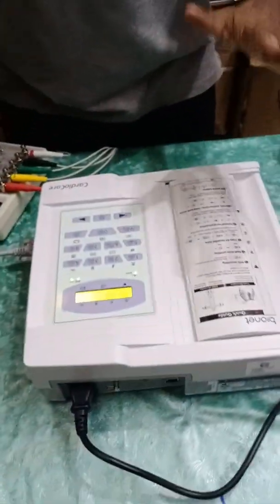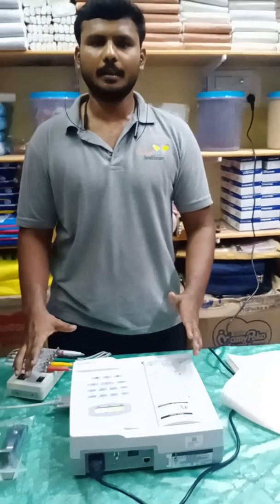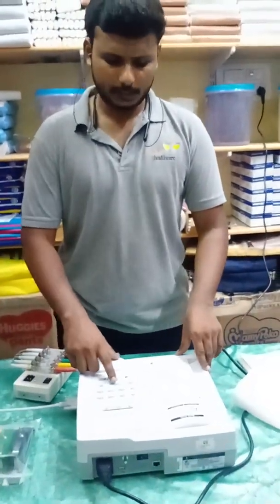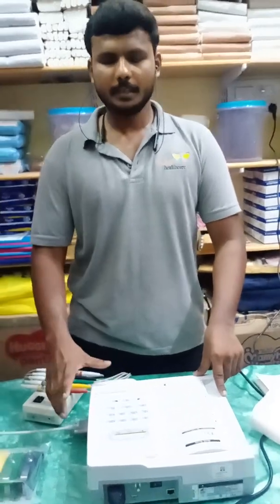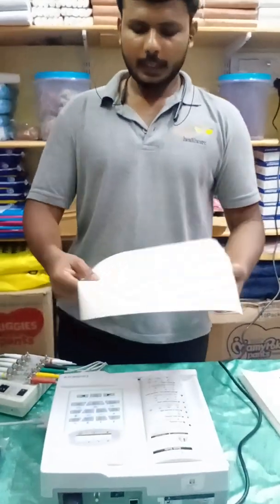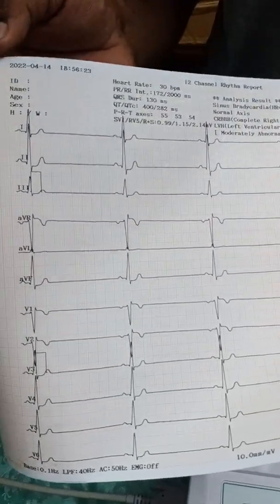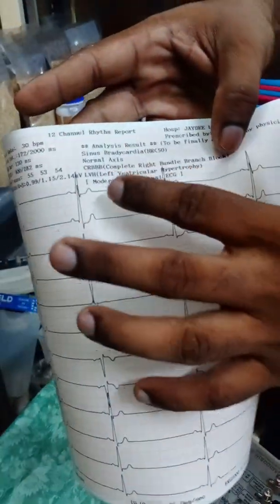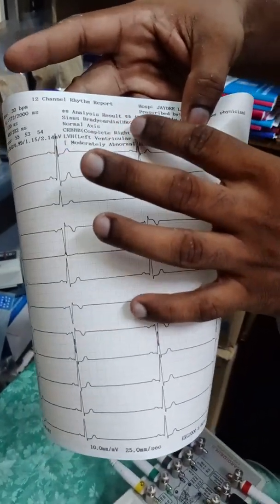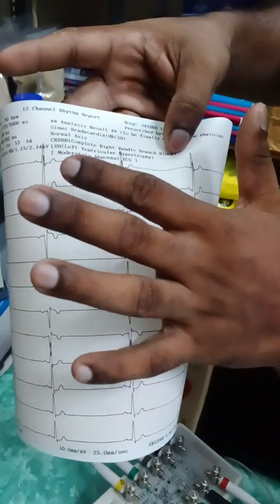After placing the electrodes at the proper pressure points on the human body and pressing the recorded printing option, the machine captures stabilized electrical signals from the patient and produces a result. In our 12-channel printout, all leads are printed very clearly on thermal printing paper. The automatic interpretation is also given in the analysis report — it reads sinus bradycardia, because the BPM is low, along with normal axis and additional clinical notes.